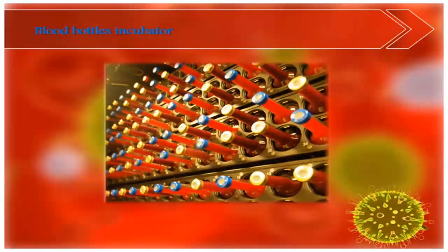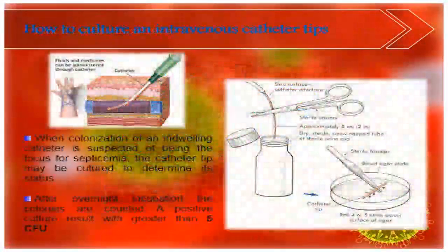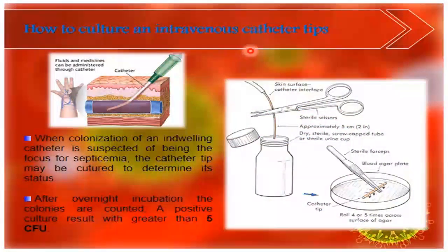Okay. These are the incubators for a blood culture. Okay. How to culture an intravenous catheter tip.